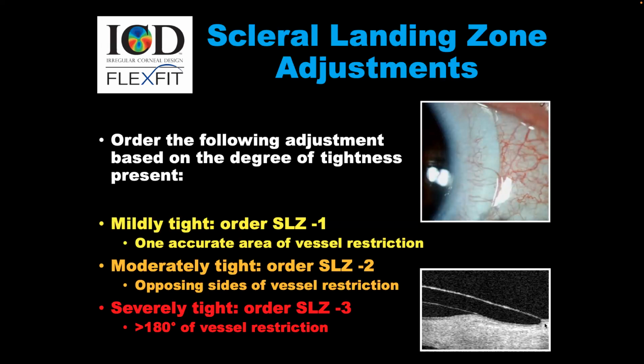If the angle of the sclera is flat, the edge could just go down, and then you will need to go up with flattening that scleral zone. So increasing the edge lift is necessary in this type of case.